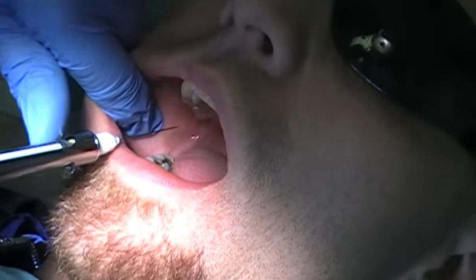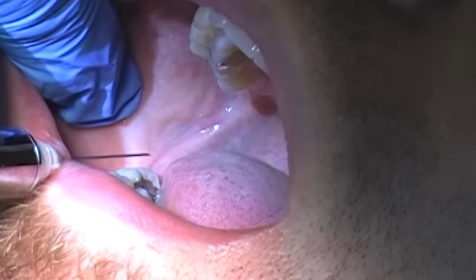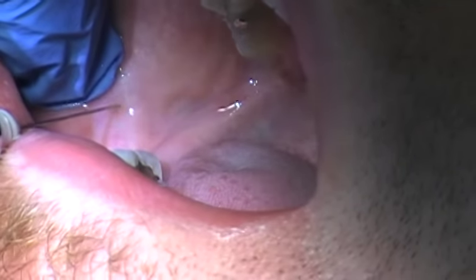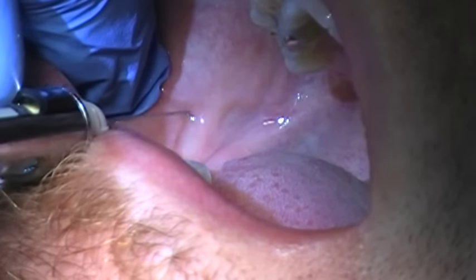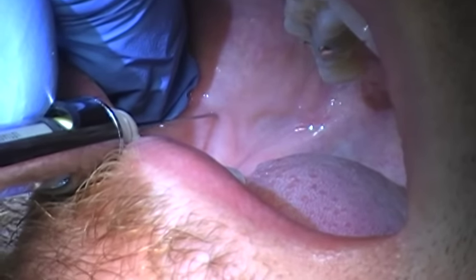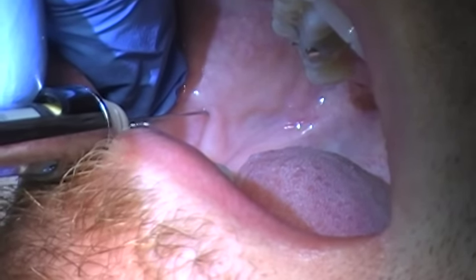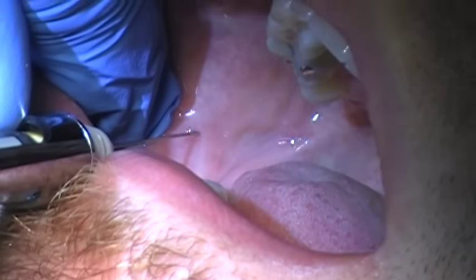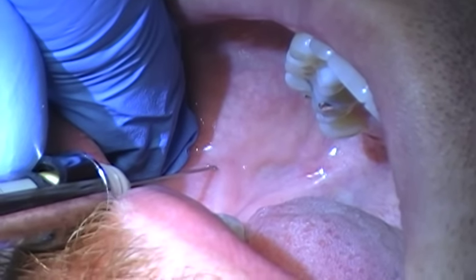As soon as you're done, save about a stopper full. Come in, go to the buccal, go about cusp height, straight out to the tissue around the external oblique area — little pinch — this one can be a little pokey. I've just covered the tissue, aspirate — it's negative. I can tell I'm already at site for him. If you're not, you can give the comfort drops, wait, and then go further in. On him I don't need to go very deep, so I'm just going to aspirate and deposit right there.